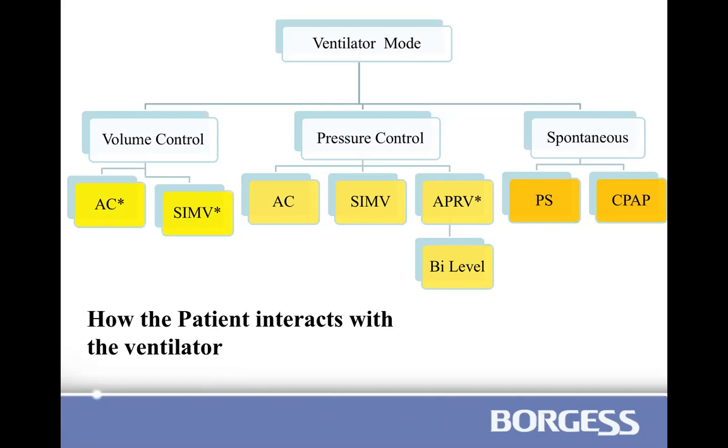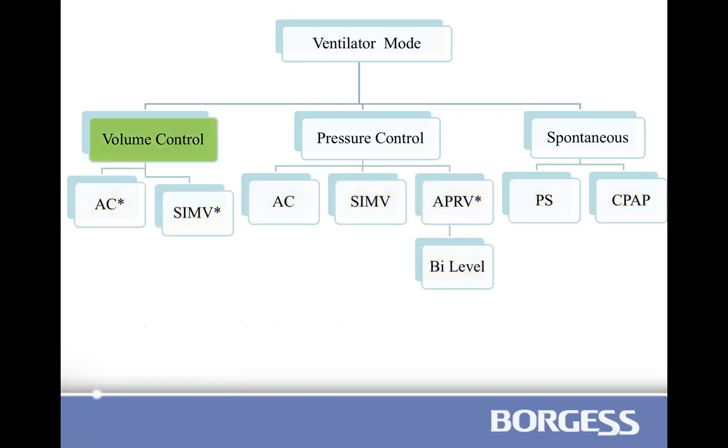Under pressure control, there are 2 others, which we are barely going to talk about. They are a little bit more advanced: APRV and BiLevel, which is a trademark name. We will cover them briefly, but those are usually the modes, sadly, that are used mostly with COVID patients. Moving on.